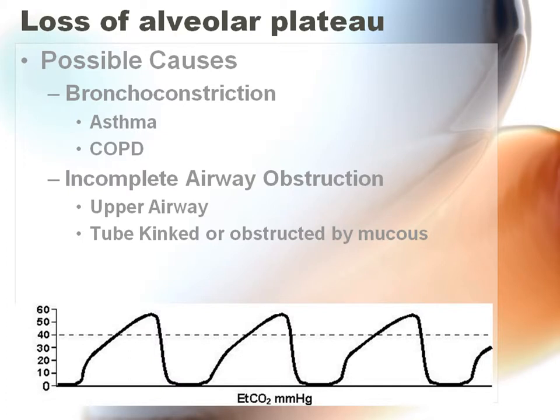So can you explain this little graph again? These are so large. That's the large airways. So that's the breathing out right there, the large airway coming out. Now we transition to the smaller airways, and they're straining their way out. This is one of the big things they are pointing out. All the dead space cleared itself out. Now the small airways are trying to push air out. It doesn't have an open path.